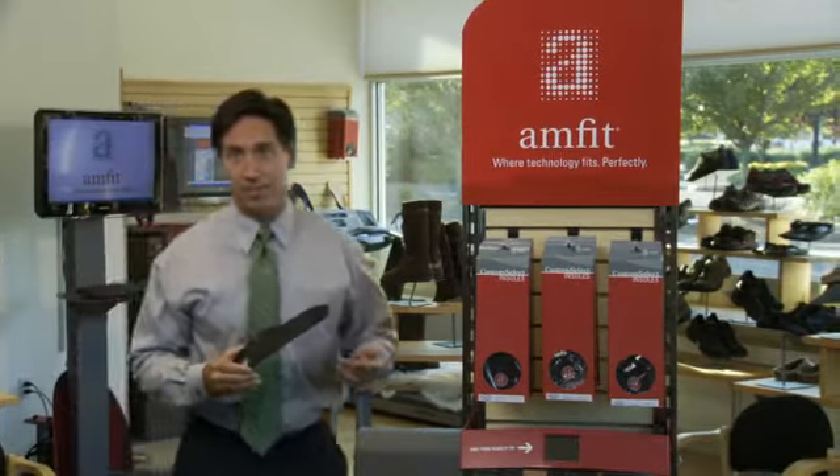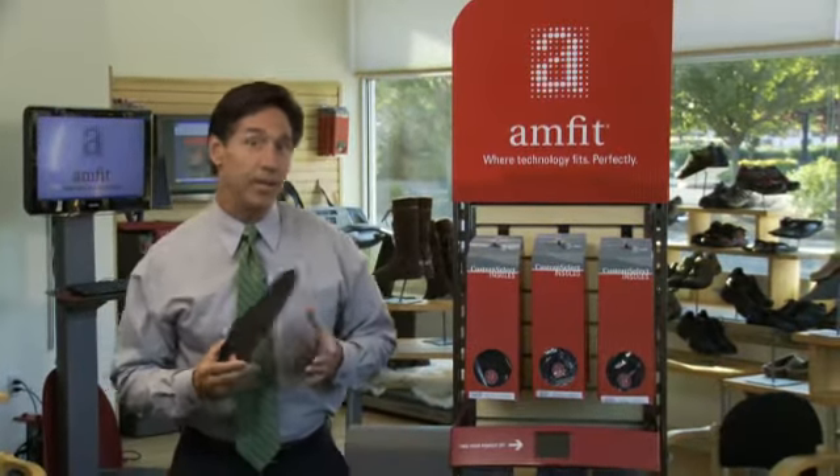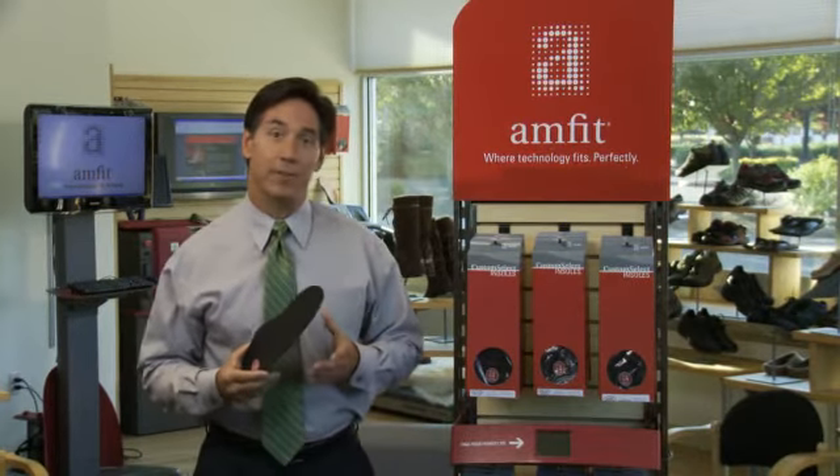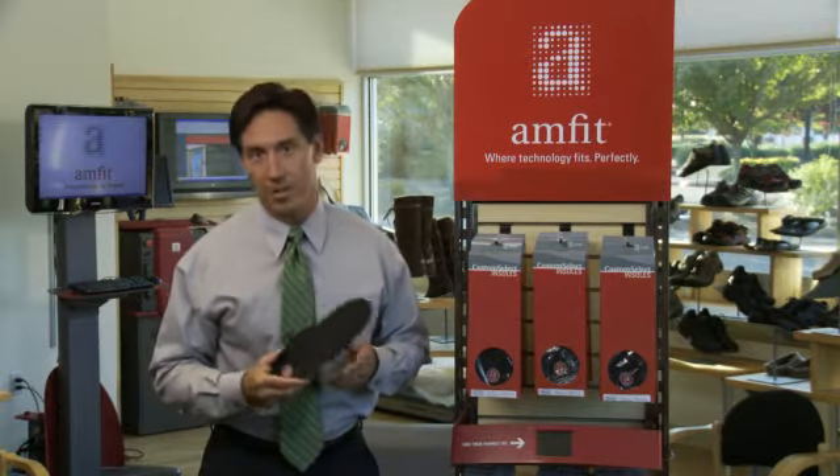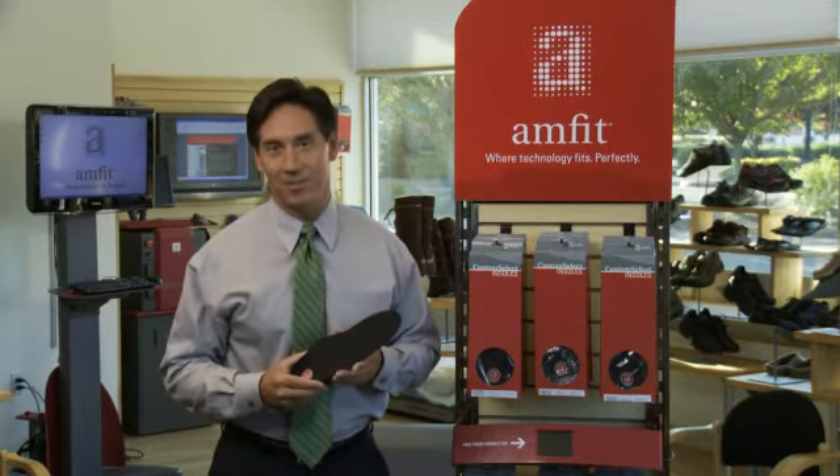Custom orthotics aren't always the best solution, and they're not the only solution. That's why Amfit offers Custom Select, a complete line of superior off-the-shelf insoles in over seventy different sizes.